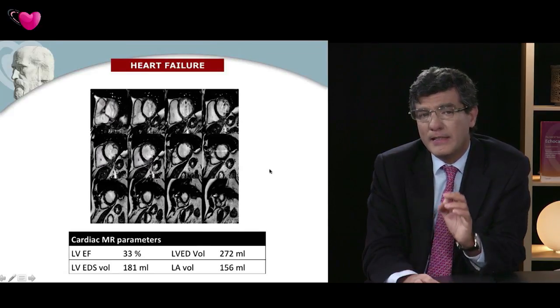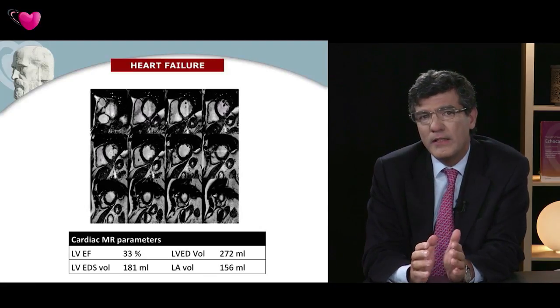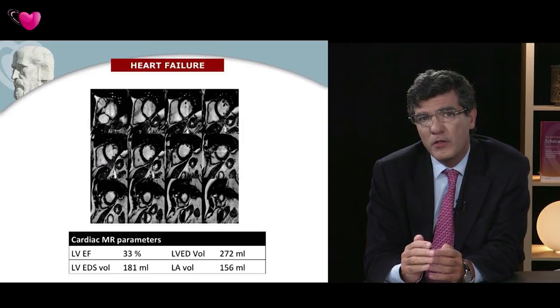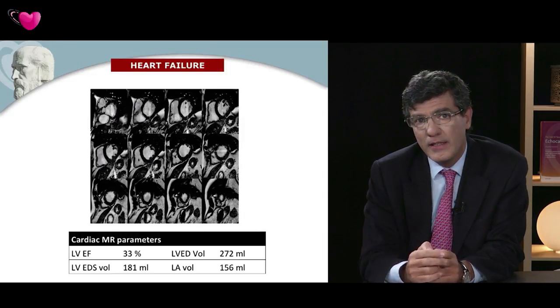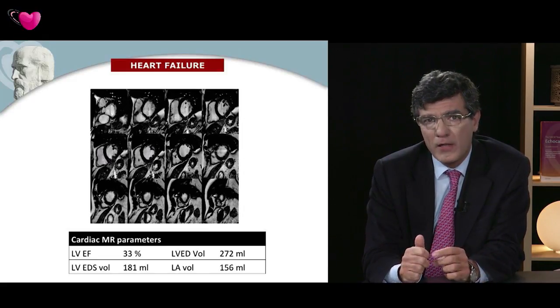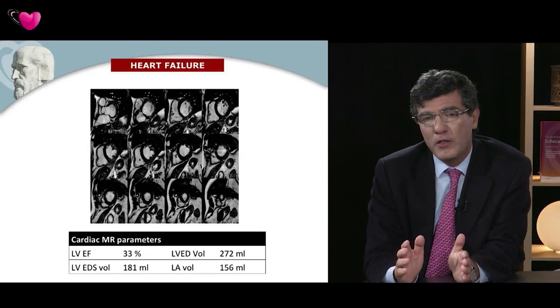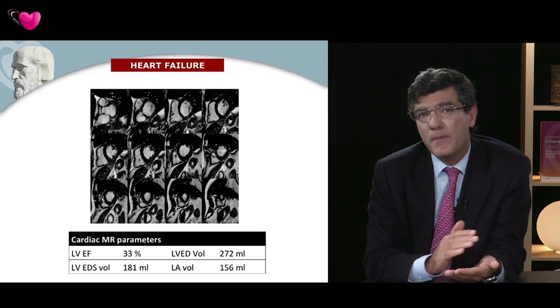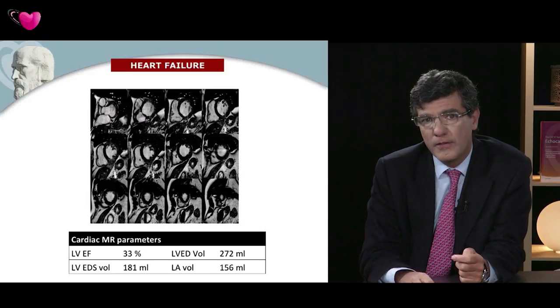In fact, this is relevant. Why? Because the difficulty in these heart failure patients is the cutoff value of the ejection fraction, because with this cutoff value, you may indicate CRT according to guidelines or not. So you really need to be accurate, and it's also extremely important for the follow-up of the patient, because it's not a single picture that we need from a patient. We need a video of the clinical history of the patient in order to take decisions.